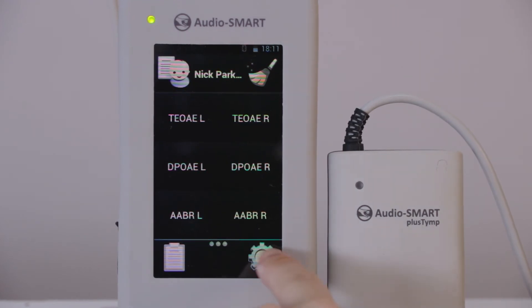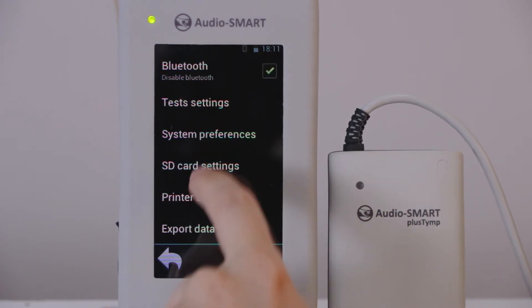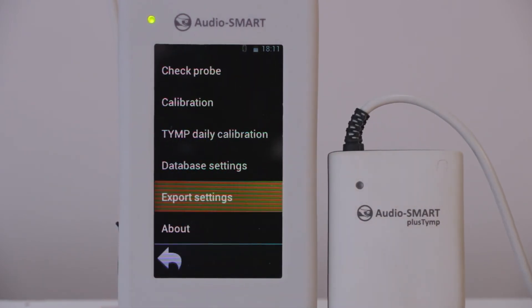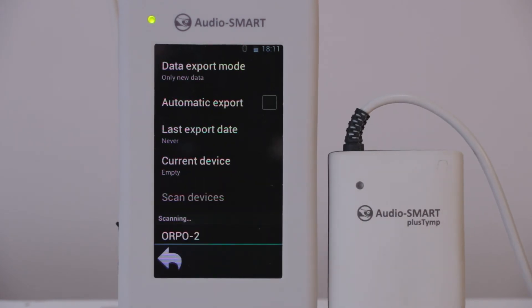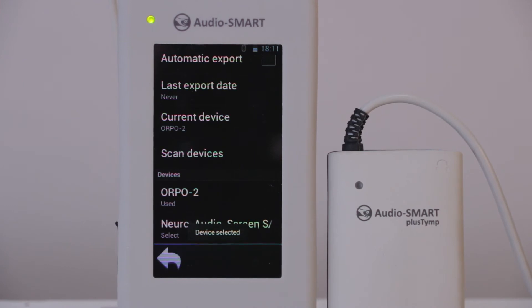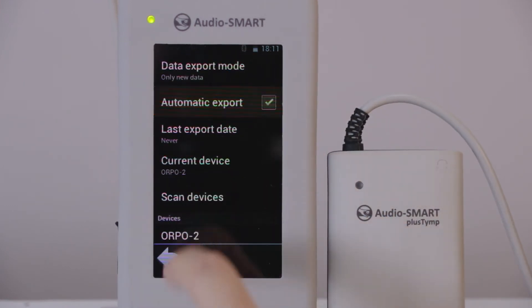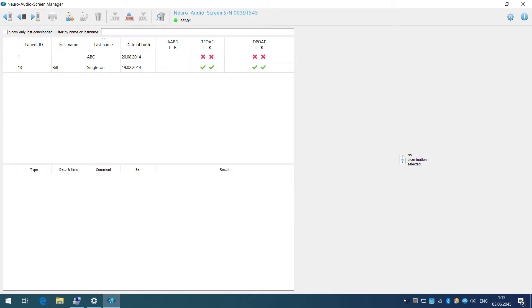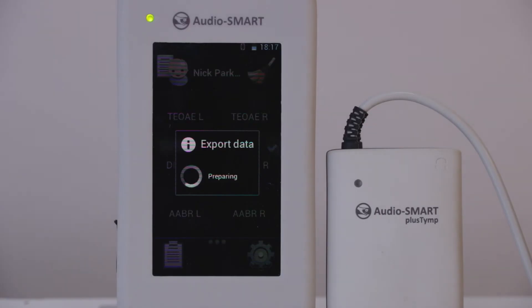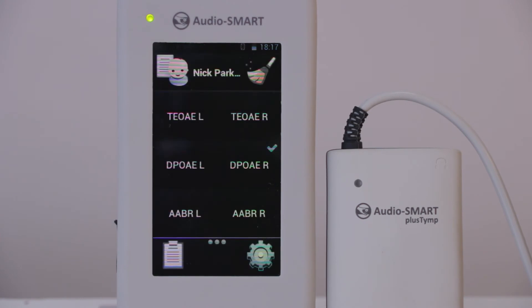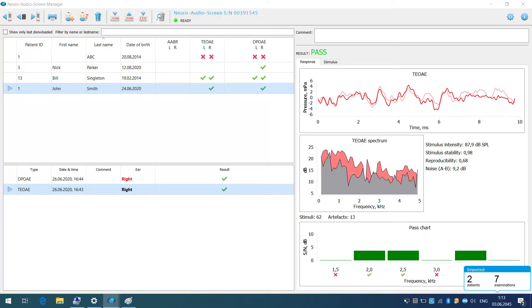If test recording is done in the same room as the computer, there is an interesting feature to automatically export data as soon as you record it on the device to the computer database the moment you save the test results. For example, perform a DPOAE test on the AudioSmart device, then click Save. On the AudioSmart device, you will see the message that export completed successfully. Immediately after, in NeuroAudioScreenManager software, a notification pop-up will appear at the bottom right corner showing the number of imported new patients and examinations.